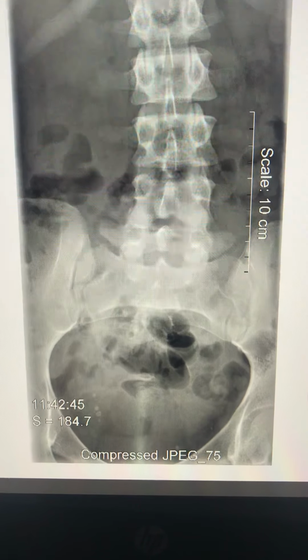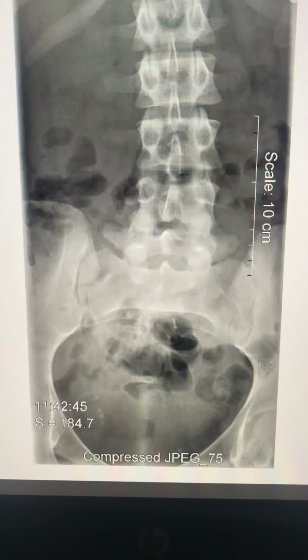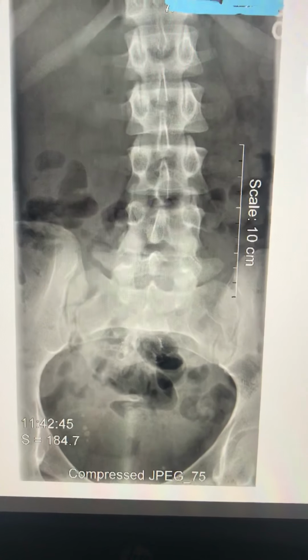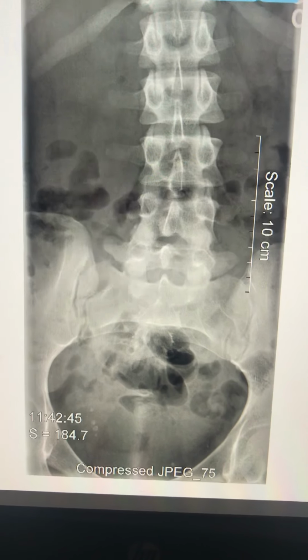The patient was changed. She was in a gown. Her shorts had a bunch of sparkly stuff on them, so we just had her change into a gown, and remove her bra and all jewelry.